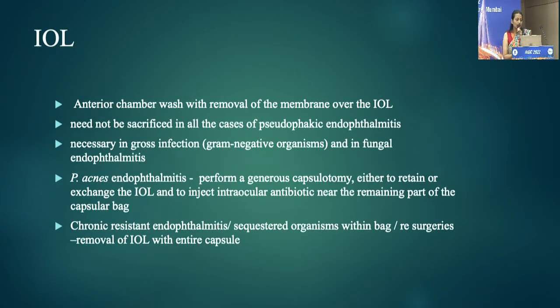The intraocular lens: anterior chamber wash with removal of the membrane over the IOL has to be done before proceeding with vitrectomy. The IOL may not be sacrificed in every case of pseudophakic endophthalmitis, but it becomes necessary in gross infections of gram-negative organisms and sometimes in fungal endophthalmitis.